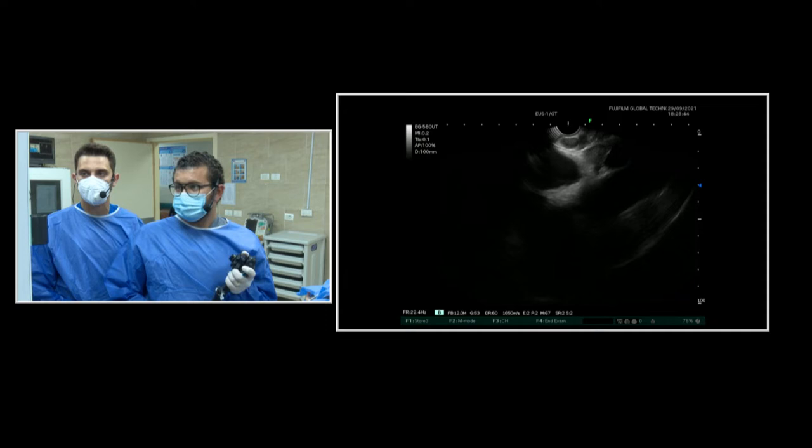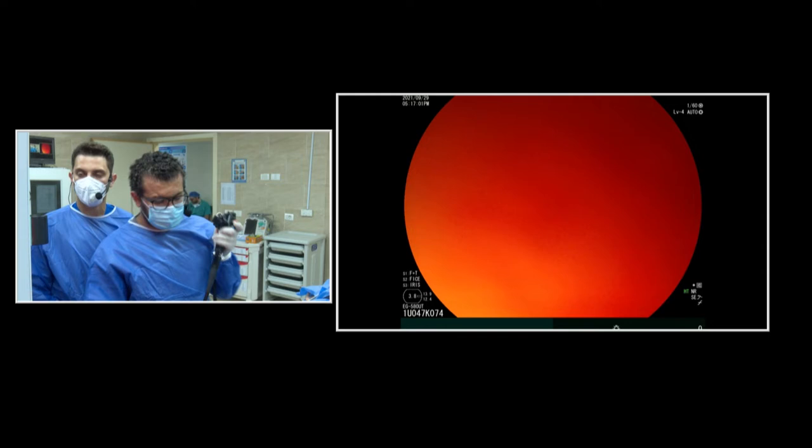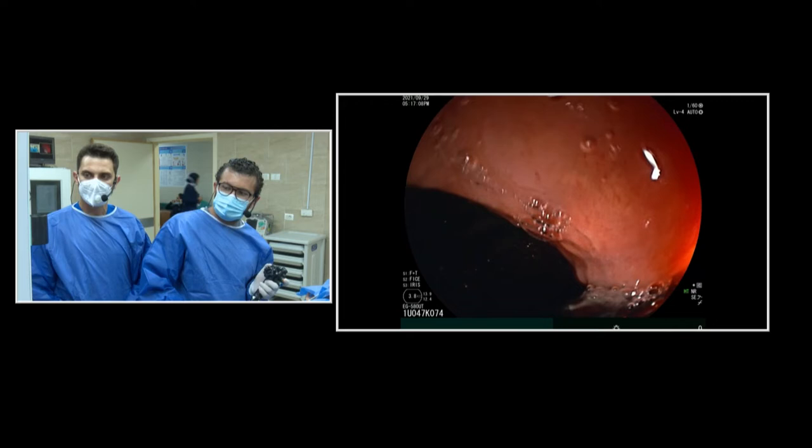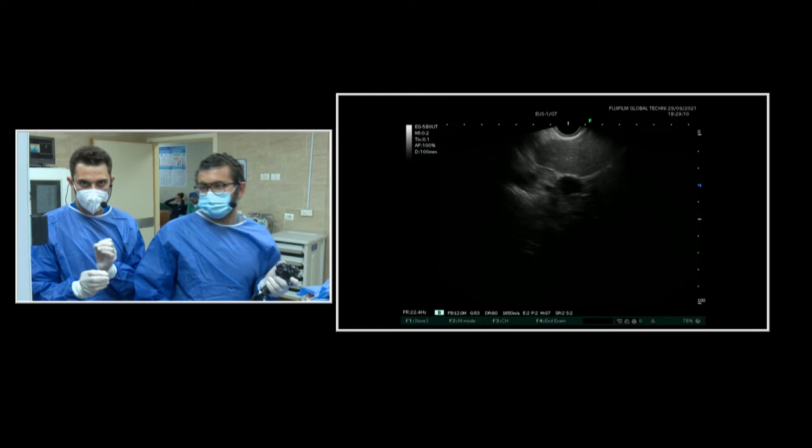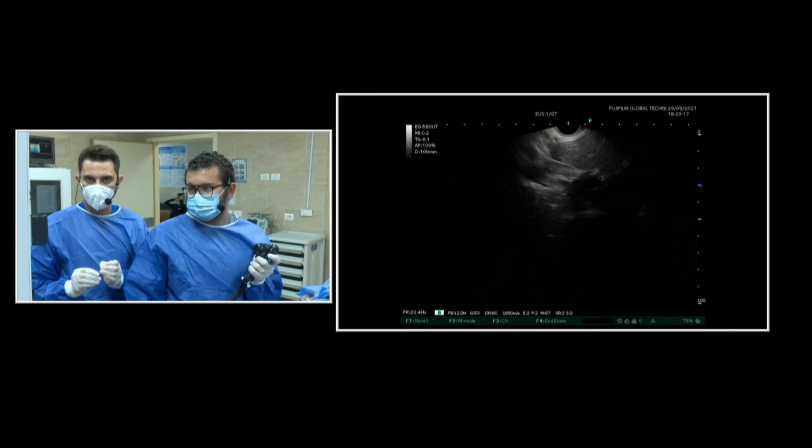This is a sign of chronicity, a longstanding disease, as Dr. Yunan has mentioned. So now we're moving further inside. This is the endoscopic view. Remember that EUS, just like ERCP, is a side-view scope, so you torque a little bit down so that you can see your way and not cause any injury, because the tip of the EUS is quite large. You have to be very careful at the introduction of the scope when moving from one station to the other, and then examine every station carefully.